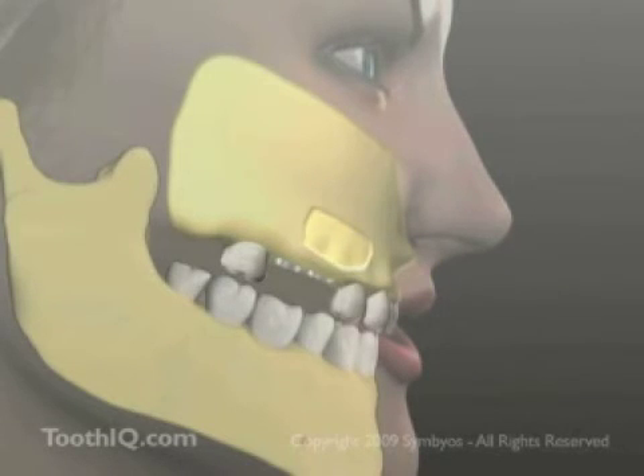The oval-shaped bone is repositioned over the access portal, and the surgical access flap is closed.